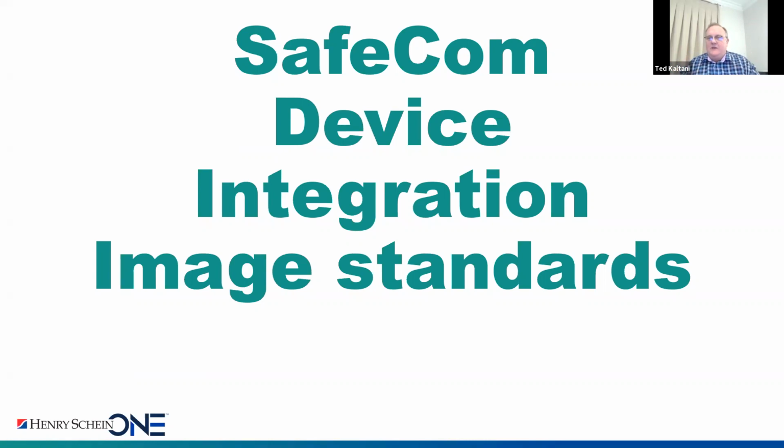Why? Because you can get any picture and put it on Photoshop, and just by filtering that image, you may create an artifact. You may create a cavity that doesn't even exist. So that's why the image coming from an approved device should not be touched on a filtering stage from the third-party imaging software. That's not the case out there. Sometimes you see all kinds of filters that can cause an image of the same tooth, same person, same x-ray look different on one imaging software from another. So just that alone tells you that there is something that should be changed or should be different.